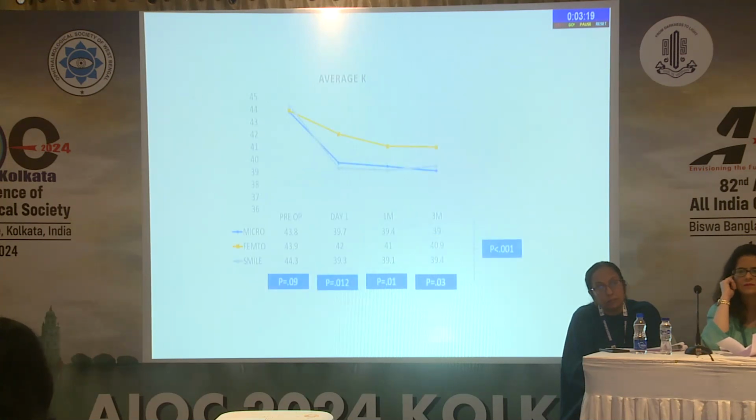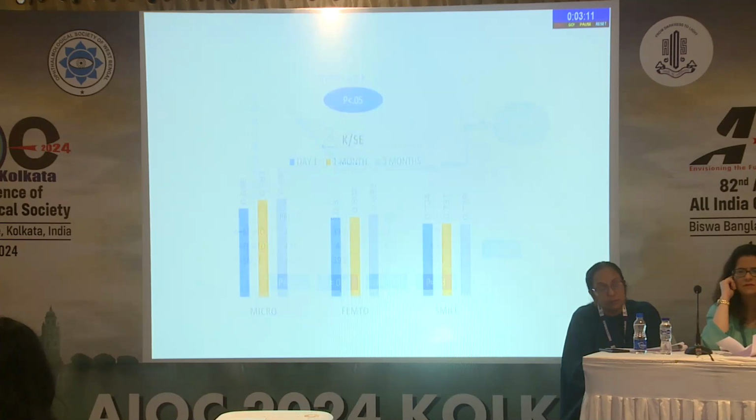In terms of average K, there was significant reduction in all the procedures, but SMILE showed a slight increase in average K at 3 months, which was statistically not significant. The change in keratometry with respect to spherical equivalent was statistically significant in all the procedures, but SMILE shows a comparatively stable delta K by spherical equivalent.